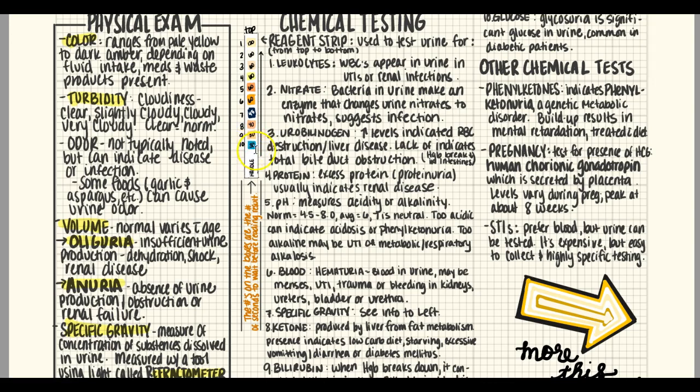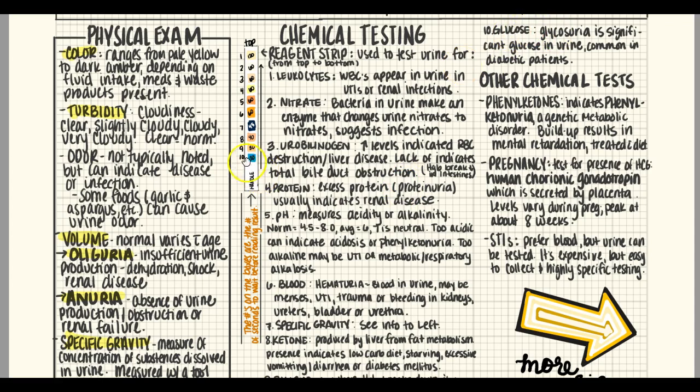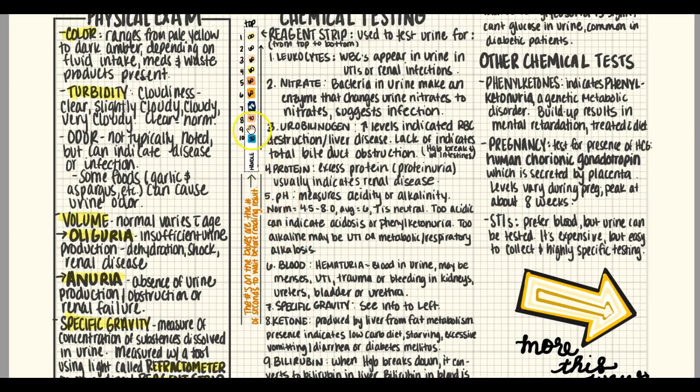And actually, the way that these reagent strips work, and this is the same for all of them, although, well, this is my little disclaimer, you should always read the manufacturer's instructions for any testing before you do the testing. But generally speaking, the reagent strips are read from the handle upward, and so you can see at the bottom the glucose square. I think that's glucose. Let me go down here and check. Oh yeah, it's over here. The glucose square is read at 30 seconds, and the bilirubin square right above that is read at 30 seconds as well. And then the ketone square is read at 40 seconds.